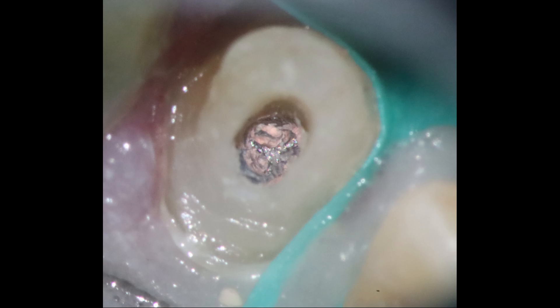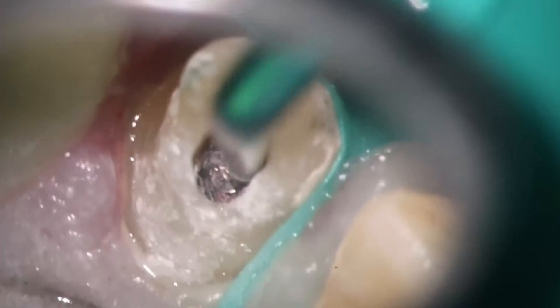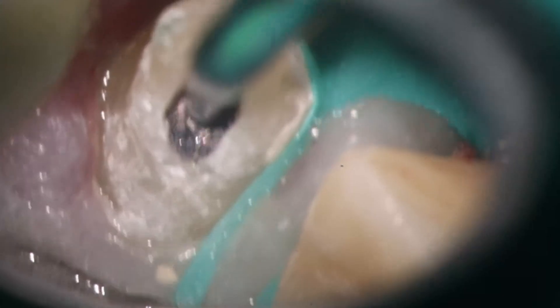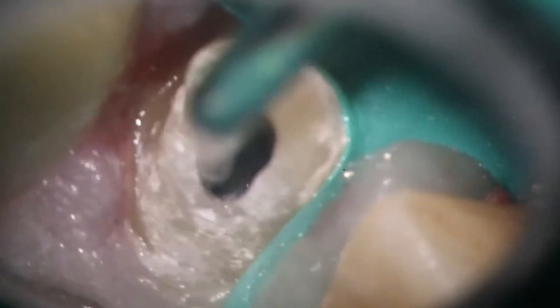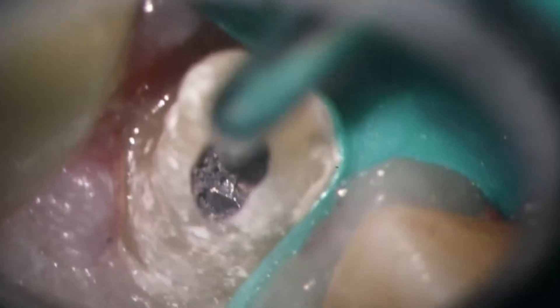You can see the three tines — the blades of the drill — and it just kind of got bound up inside there. So the first thing I'm going to do is see if I can get this thing loose. I like using this little E2 deburr at about 75% power, doing it dry so I can visually see if it's mobile. The good news is this thing is pretty loose. I don't know if it was overstressed or fatigued, but it somehow broke off. Spoiler alert: there is actually a thermophil carrier in here too. I think the post drill was binding up, grabbed the thermophil carrier, and that's what snapped it off.